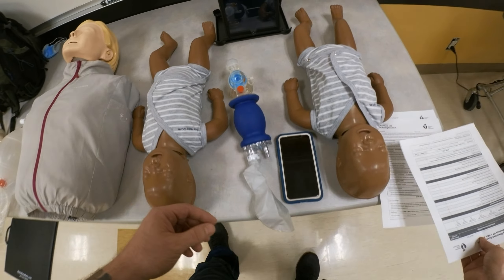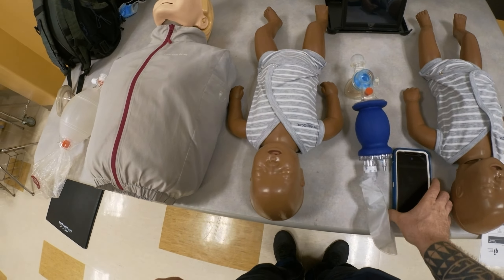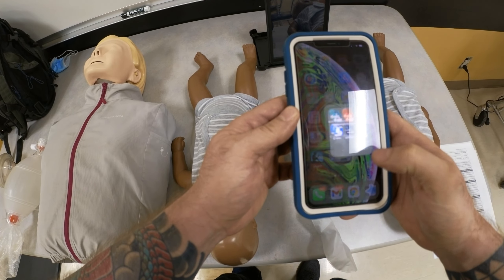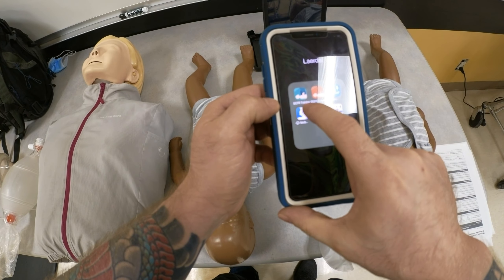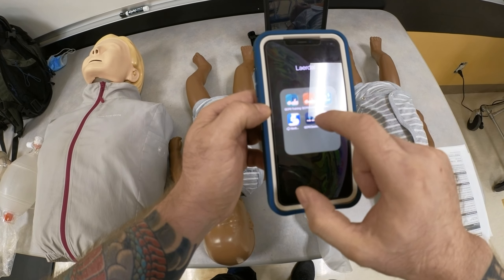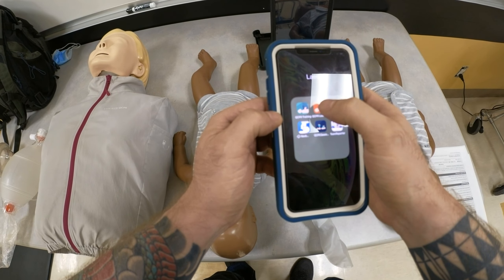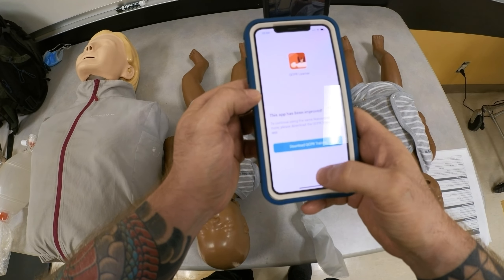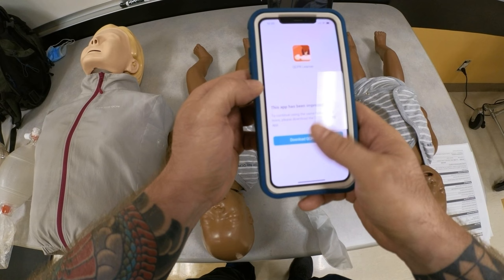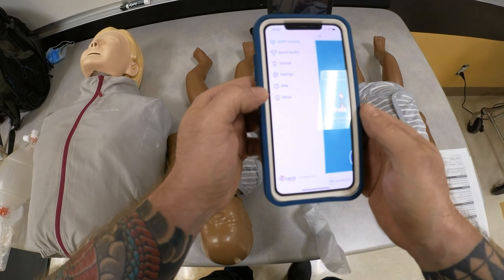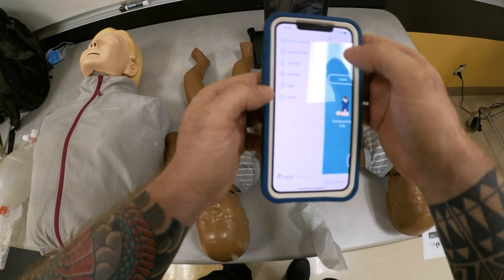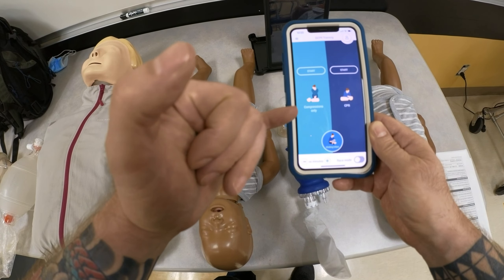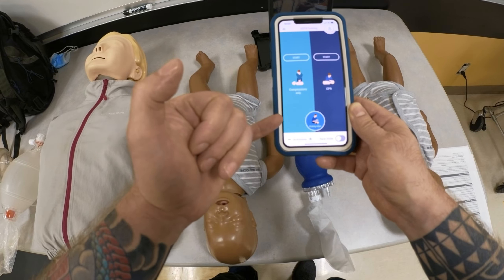The app you're going to download in the App Store is called QCPR Training. They previously also had QCPR Learner for students to pair with one mannequin, but they discontinued it. So the only app you're going to use right now is called QCPR Trainer, and this will allow you to connect up to six mannequins. You can monitor compressions only, CPR, or choking infant.